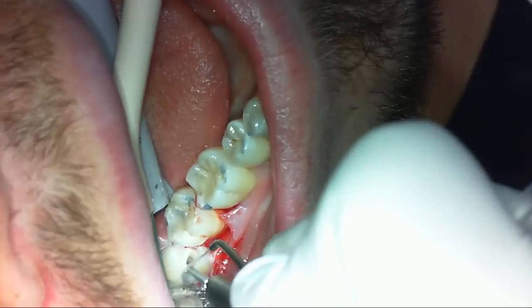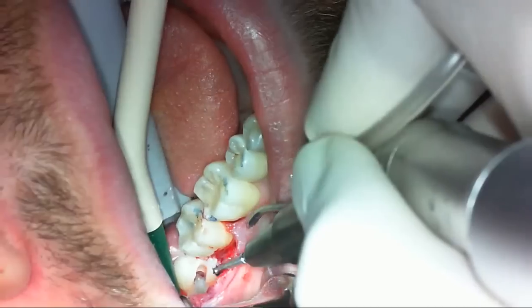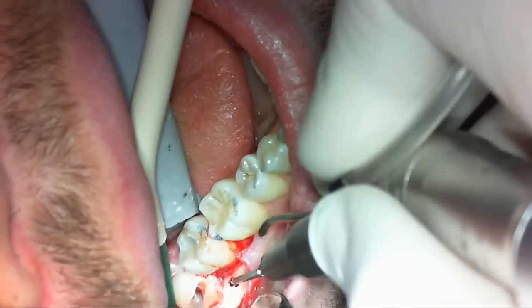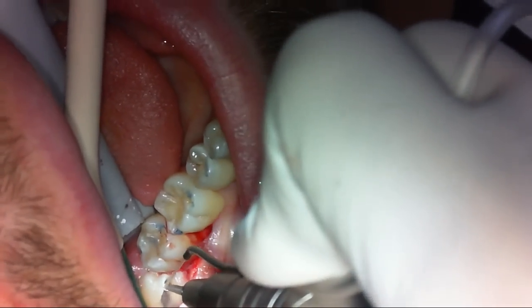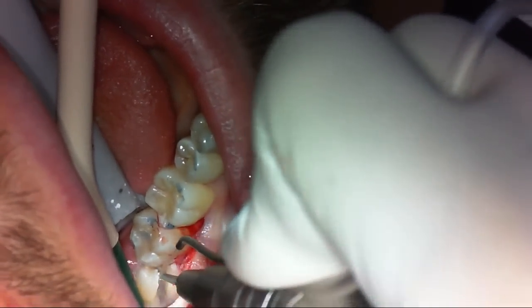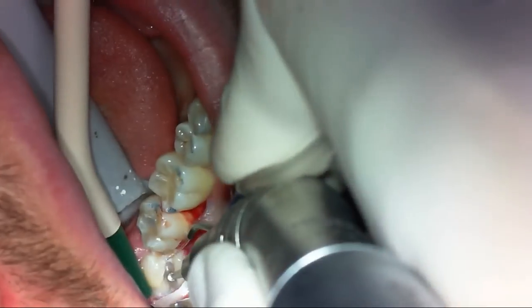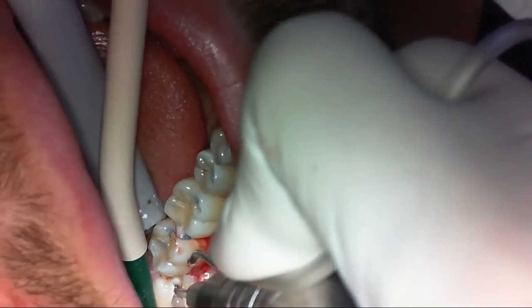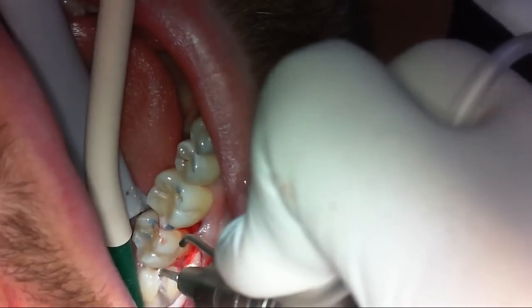This way is safer, quicker, and gives you better orientation — you always know where you are cutting into the tooth. This surgery is done under 3.5x magnification, which helps a lot with extra lighting as well. I work the bur coronally and apically. Lingually, we want to go maybe 90% of the way — you don't go all the way through because you can't see well and risk going through the lingual plate or mucosa and injuring the lingual nerve.